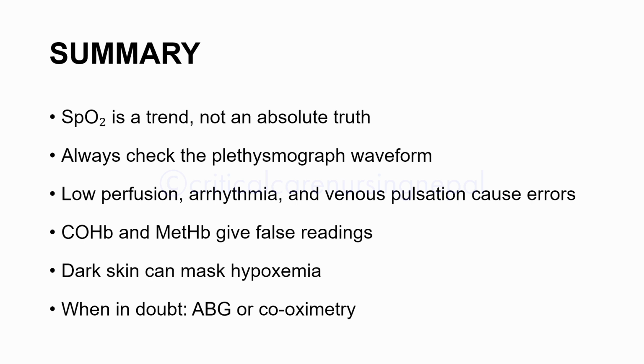Now, think of the last time you saw a pulse oximetry reading that didn't match the patient. What was the cause? Motion, perfusion, or cardiac output? If you are in training, I challenge you to go to your ICU today and find one patient whose waveform is poor. Figure out why, fix it if you can. So post your cases in the comments. Let's learn from each other.